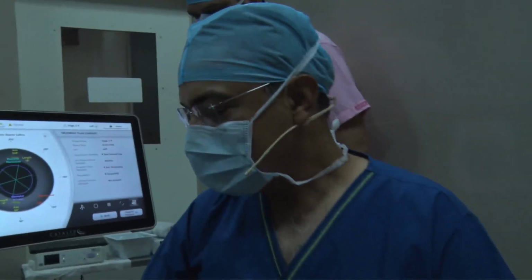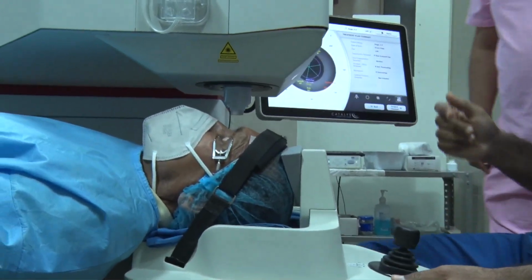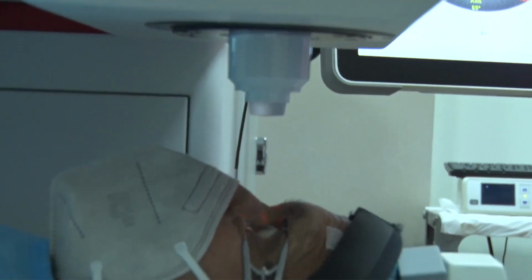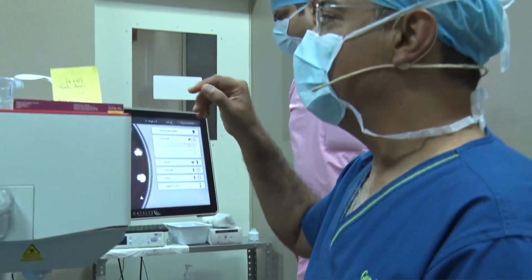The good thing about the Catalyst is that it comes with a fluid interface. So the Rexis is over in about 1 second, especially if you're doing an intumescent cataract. It's my first choice. There are patients who don't pay us also sometimes, and if there's an intumescent cataract, I'll still sometimes do this and absorb the cost myself for an occasional patient.